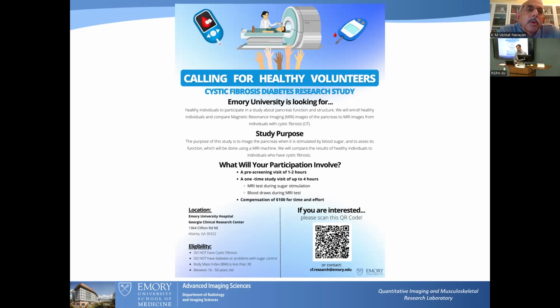What about doing it endoscopically? For example, upper GI endoscopy, to get more proximal to the pancreas with a radio coil. I've never really thought about it like that. I have definitely seen experimental situations where coils have been applied internally like that to improve sensitivity.